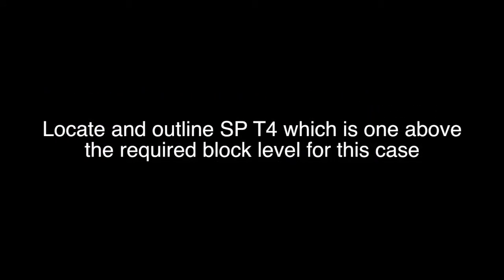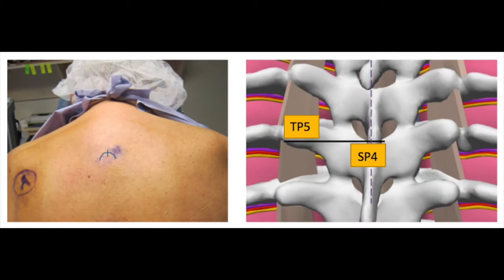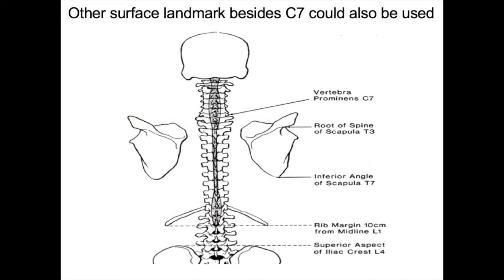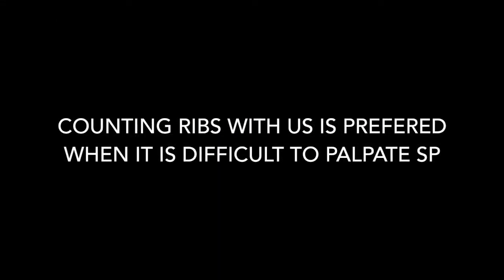Remember, when practicing with this simulator, the most cranial spinous process that can be palpated on our model is SP2. You want to locate and outline spinous process T4, which is one above the required block level for this case.